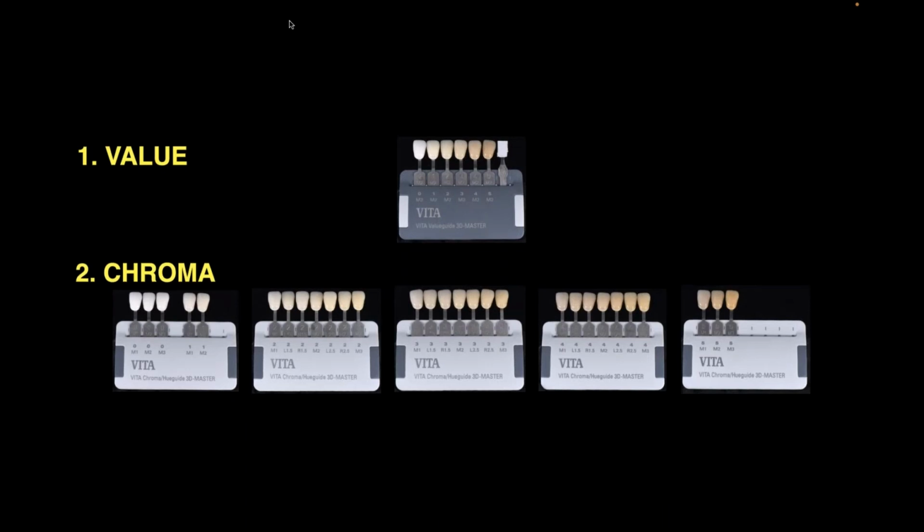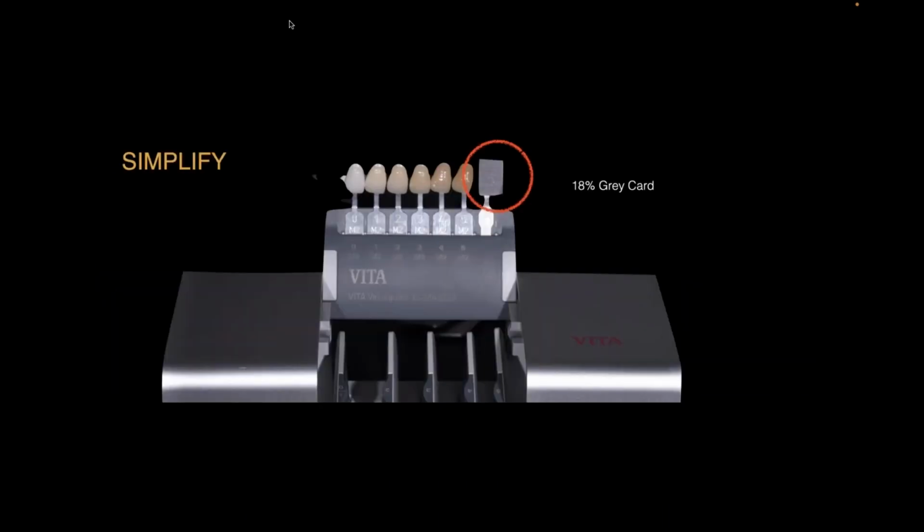The letter R really stands for red. And every time I'm incorporating more red into the ceramic, I'm lowering the value of the ceramic. So I'm actually getting more light absorption and lowering the basic value. So the simplicity of the system is, one, what is my basic value of the tooth? And now that I know what that is, is it more in the yellow or more in the red family? So it's a very basic and simple system. And that's what we tend to use with most of my doctors today. It really works a lot better.